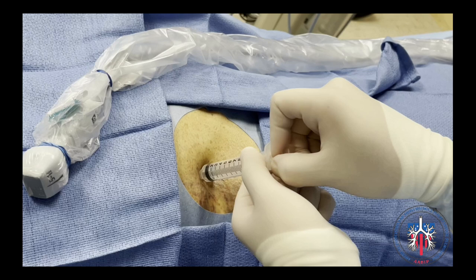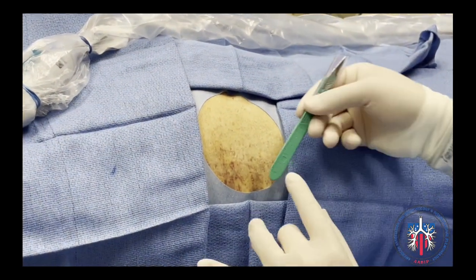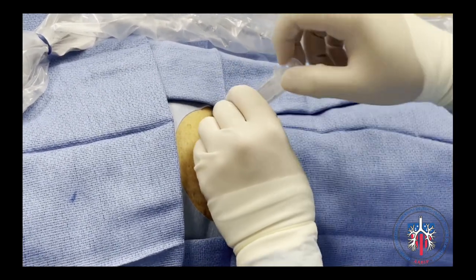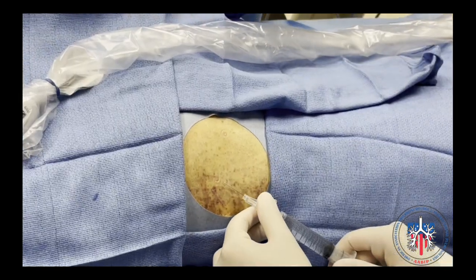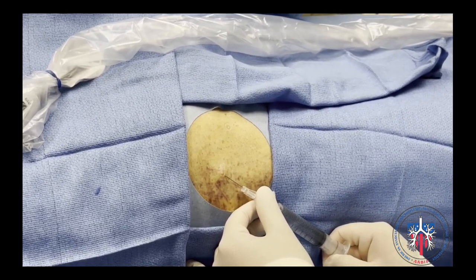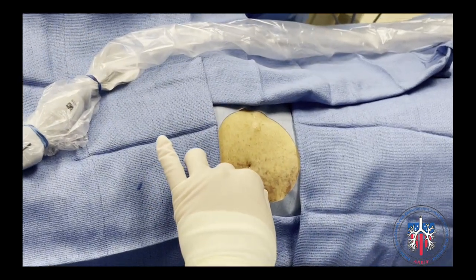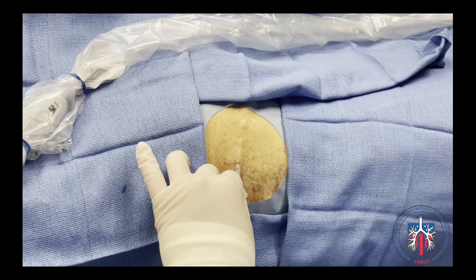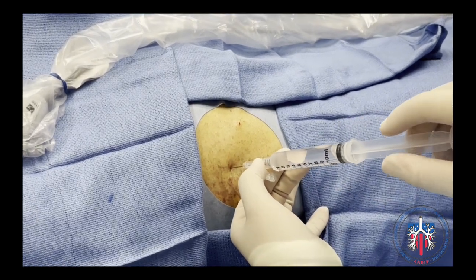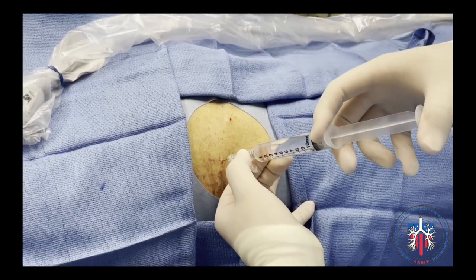Marking can be done with either a sterile marker or by leaving an imprint made by pressing the tip of a syringe onto the surface of the patient's skin. Next, an exit point is identified and marked — this is typically 5 cm anterior to the entry point. The entry and exit points are then anesthetized with 1% lidocaine. The pleural tract via the entry point is also anesthetized with 1% lidocaine, applying negative pressure on the syringe when advancing towards the pleural space, injecting lidocaine at every 1 cm increment.